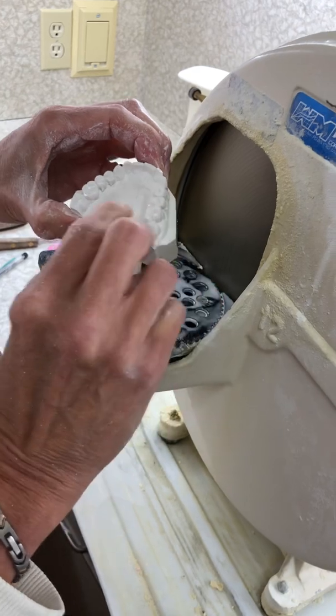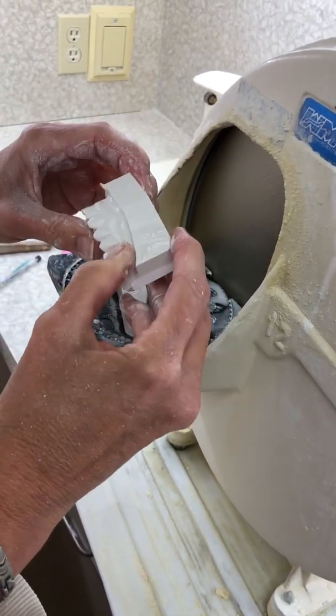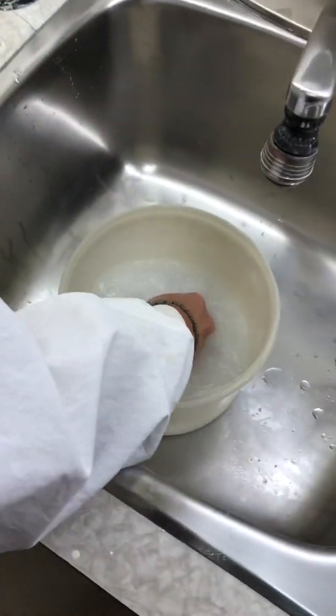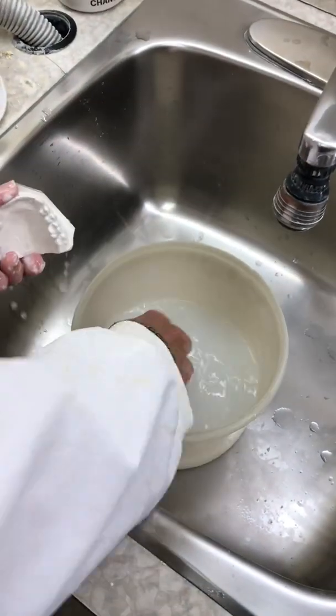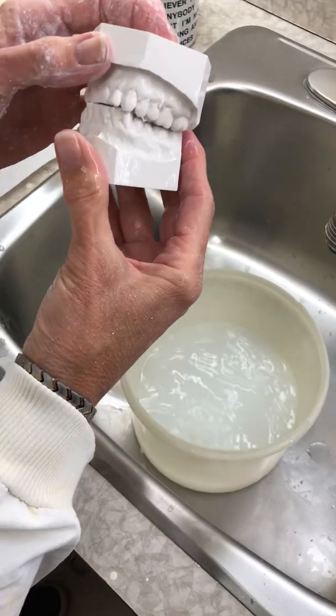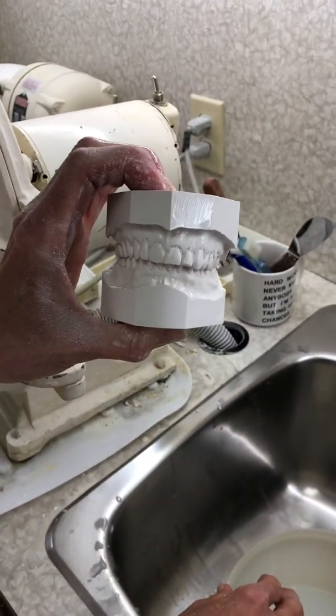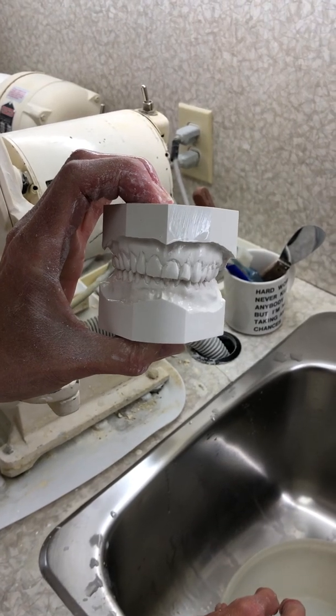And again, we'll trim those off when we go to finish the model up for viewing for the patient. So let's just again rinse them off. And there is a nicely trimmed orthodontic model.